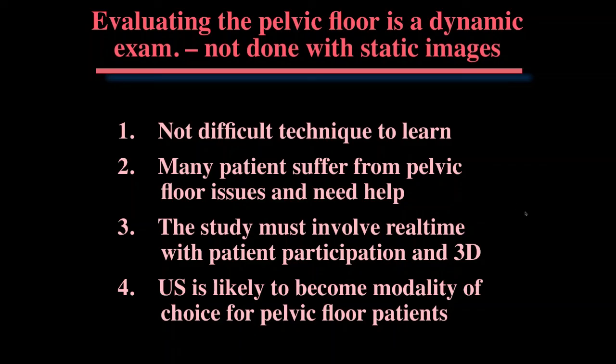How many of your images are from endovaginal probe and some using a 3D probe? How do you decide which to use? I use a transvaginal probe only. I don't use a 3D probe. One of the main reasons is I don't know how to disinfect it.